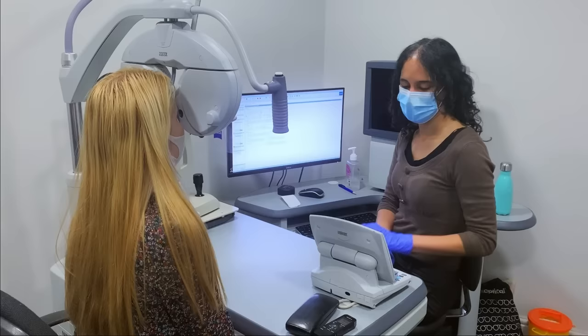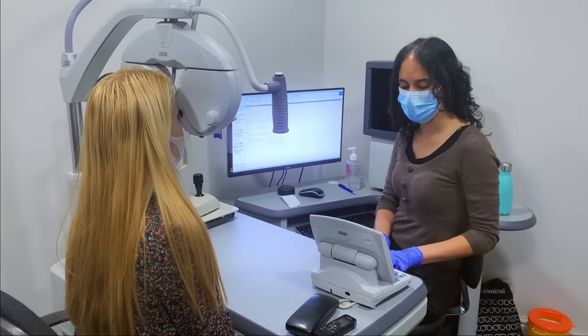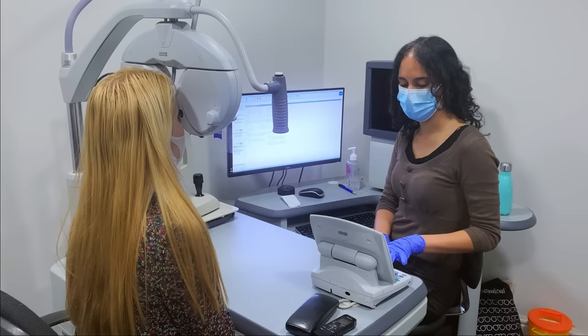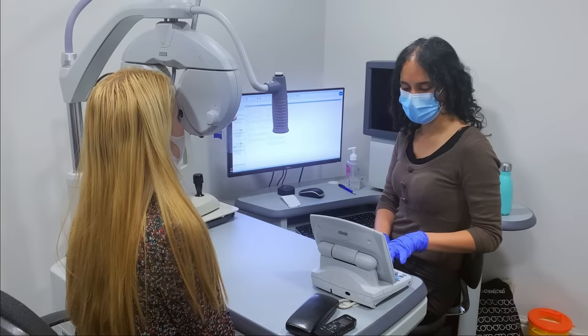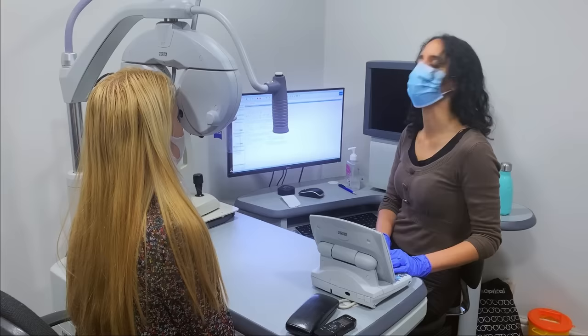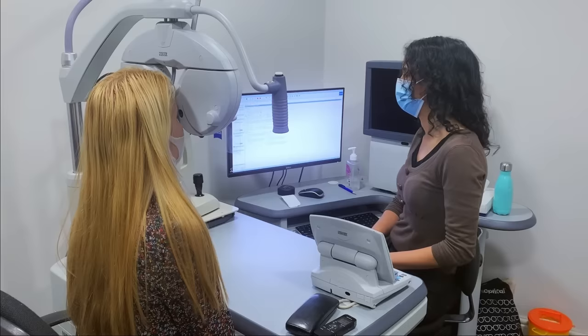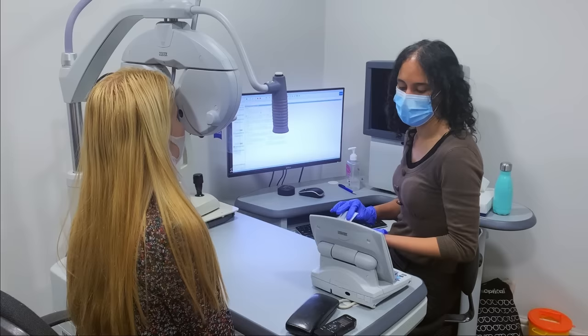Okay, great. So now if you can have a look at these black circles, are they clearer and rounder with either number one or number two? Number one. Okay, good. And between number three now and number four? Three. Okay, good. Lovely. And between number one now and number two? Number one. Okay, brilliant. So looking back over to the middle line, is it clearer with number one now or number two? Number one. Good, excellent. And between number three now and number four? Number three. Good, lovely. Is the middle line okay to read there now? Yeah, V, F, L, N. Good, excellent. Can you read any from the bottom line there?